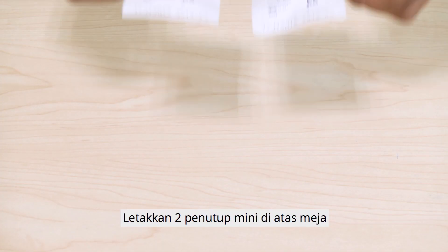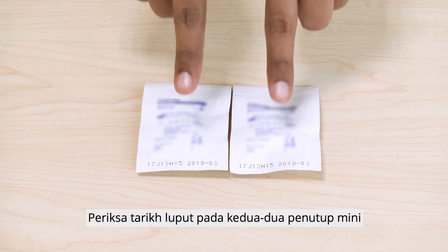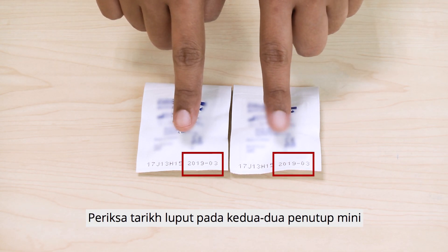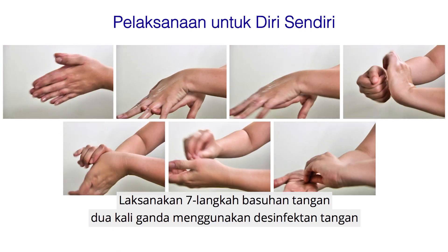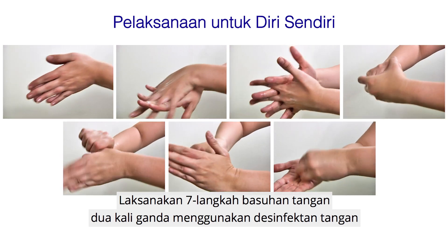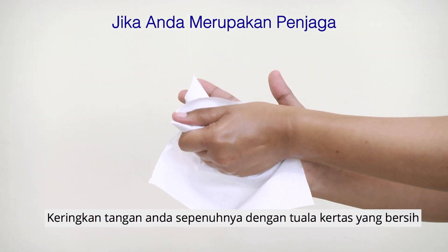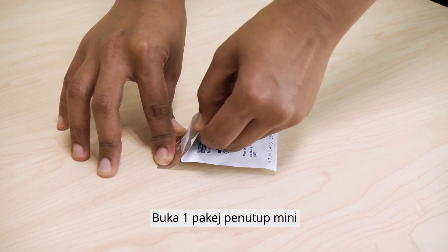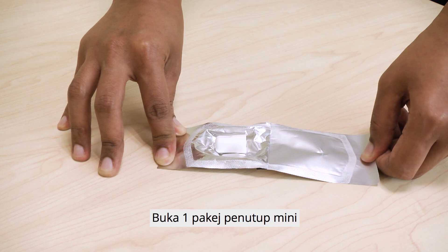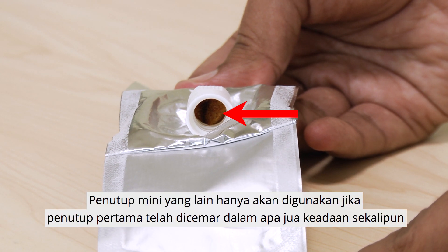Disconnection. Place two mini-caps on the table and check the expiry date of both mini-caps. If you are performing the therapy yourself, perform a double seven-step hand rub using the hand disinfectant. If you are a caregiver, perform the seven-step hand washing and dry your hands completely with a clean paper towel. Open one mini-cap package and check for the presence of the iodine sponge. The other mini-cap will only be used if the first mini-cap is contaminated in any way.